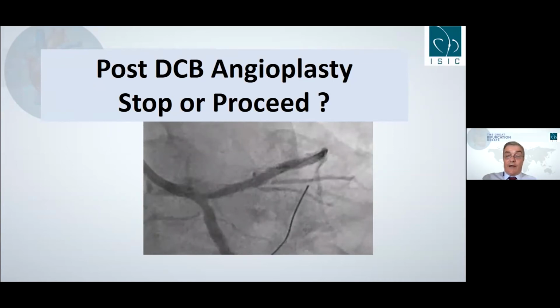Prof. Santoso, just for my understanding, when you say DK crush, does that mean you will go with balloon towards the circ, crush with the LAD stent, do the kissing, and then stent the circ and repeat kissing? Is this the strategy that you are recommending? Yes. Okay, thank you. Just for clarification for me and for our participants.